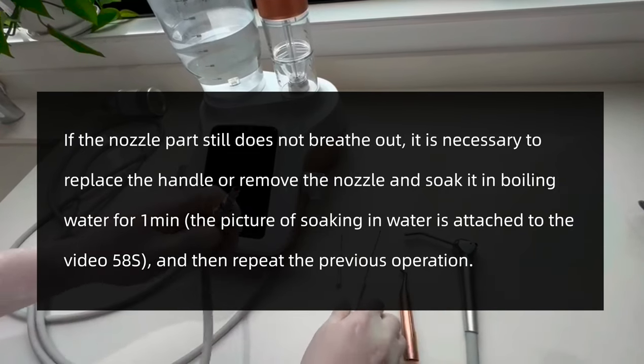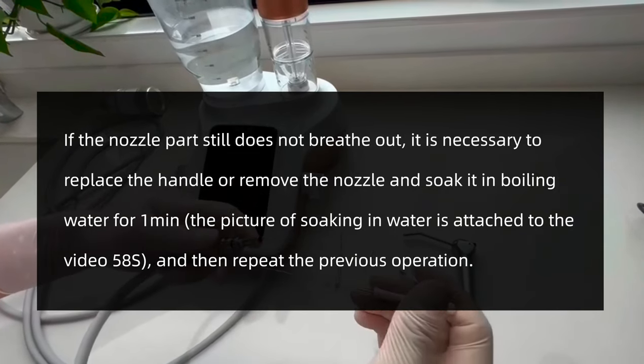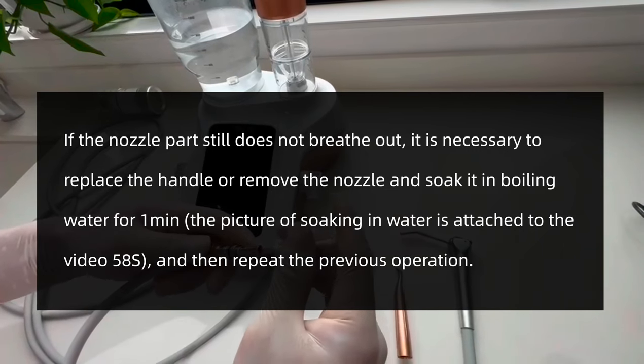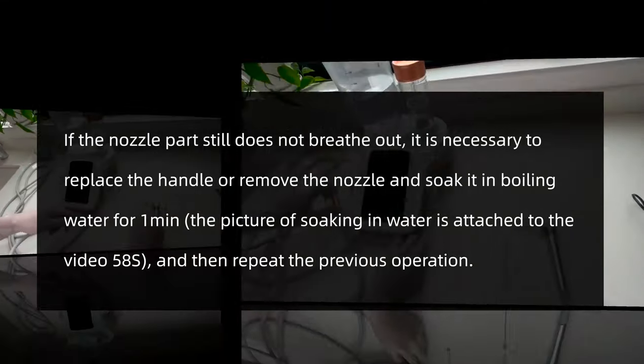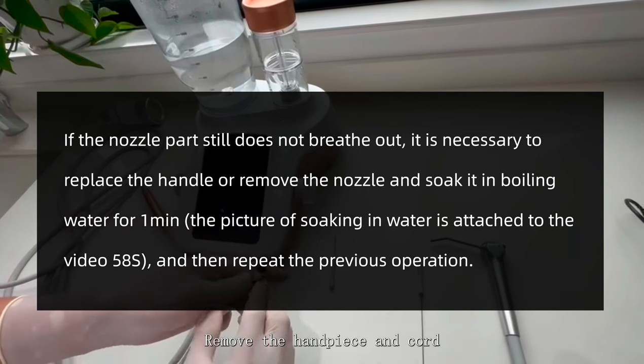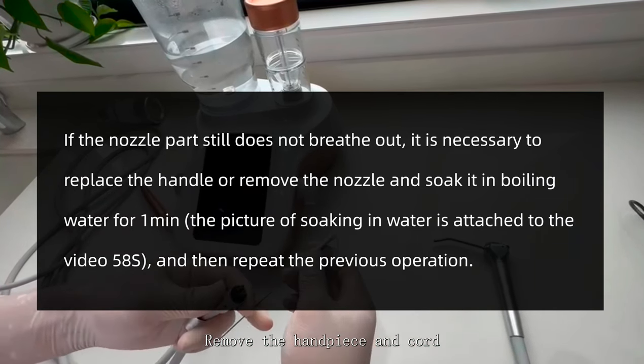If the nozzle fails to emit air during normal working and still does not emit air when the handpiece is removed, but after the cord is removed there is air out of the main unit outlet, it indicates a blockage in the cord. In such cases, the cord needs to be unblocked.